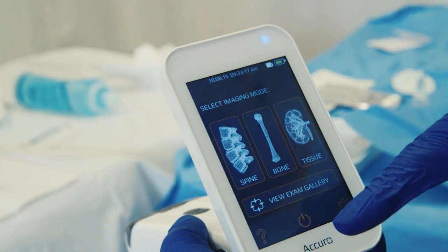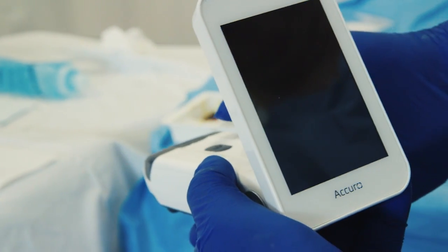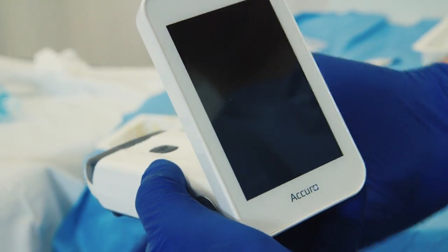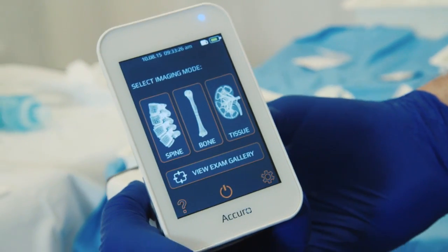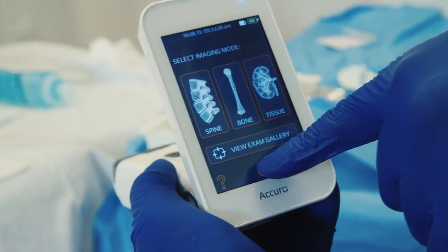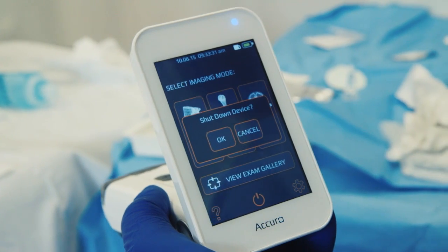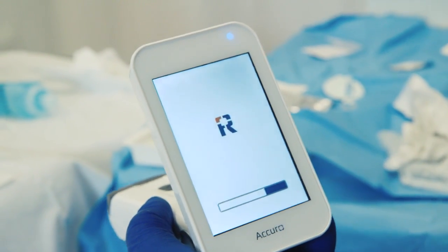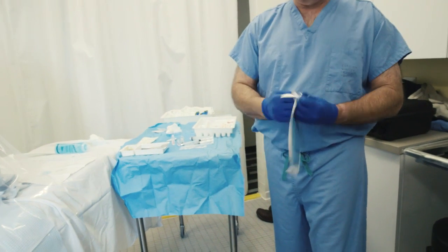The Acuro can be placed to sleep by tapping the physical power button; the device will wake from sleep rapidly when needed. To power down completely, press the power button on the home screen. Do not hold down the physical power button to turn off the Acuro unless absolutely necessary.